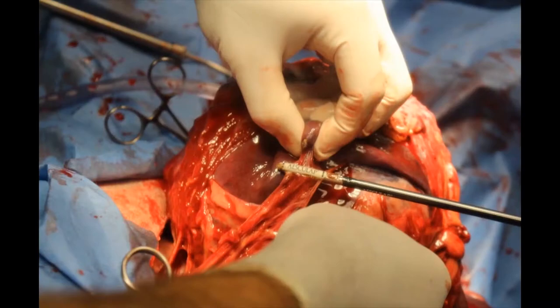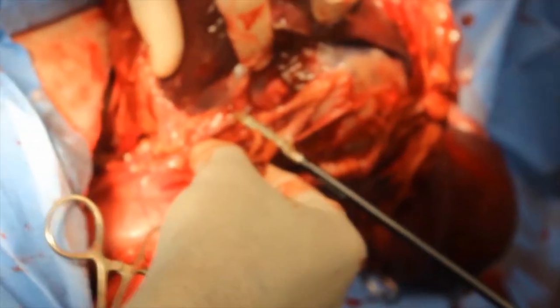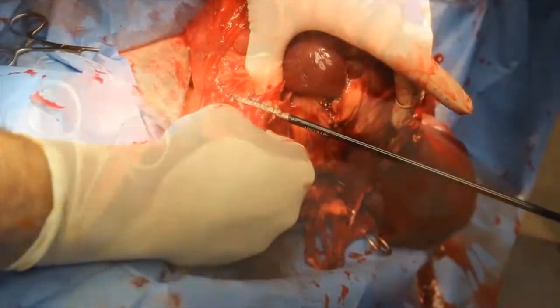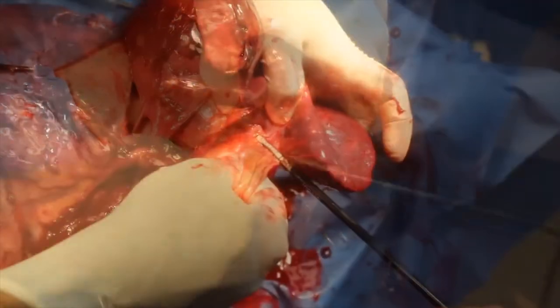The Cayman Vessel Sealer is FDA approved to coagulate and cut vessels up to 7mm in diameter. This becomes tremendously helpful when that hemoabdomen arrives on a Friday night. All of the short gastric vessels along with the splenic hilum can be quickly coagulated and transected with the Cayman Vessel Sealer.